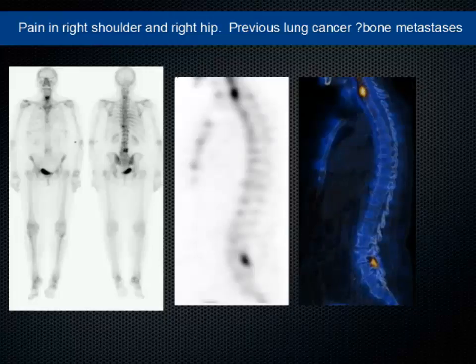But again, it depends on how much experience you have. If you go from the first year, second year, third year students, I would always sit on the fence saying that because the patient has got cancer, it could be benign or could be malignant, but without correlative imaging, I would not just pass it out as normal, it's degenerative. You have to be quite brave on a bone scan to just let this off as benign. So you have to have some correlative imaging to make a definitive diagnosis.